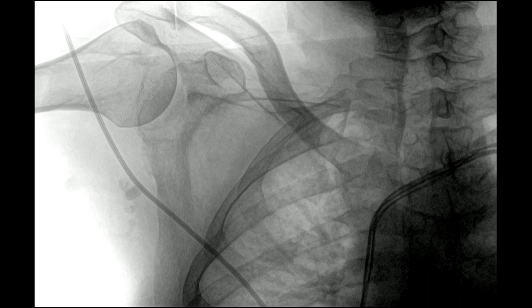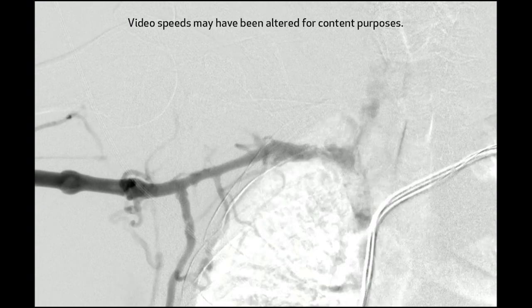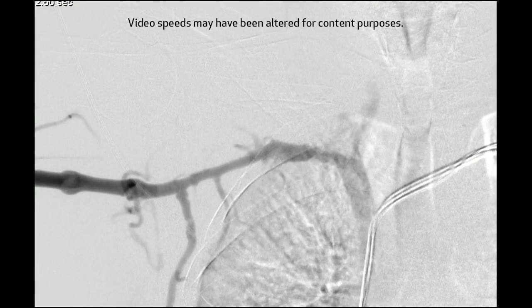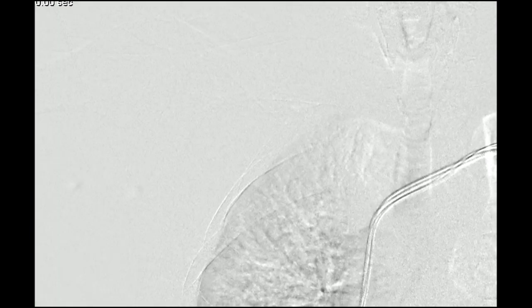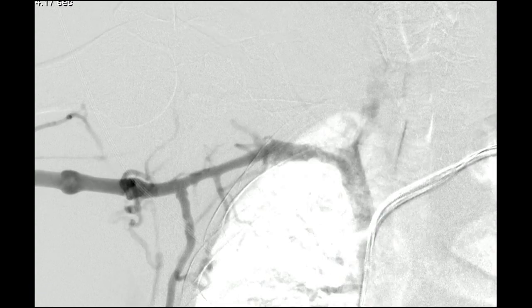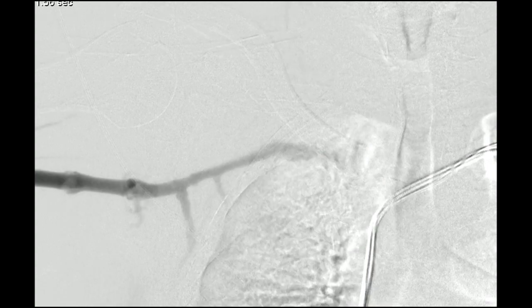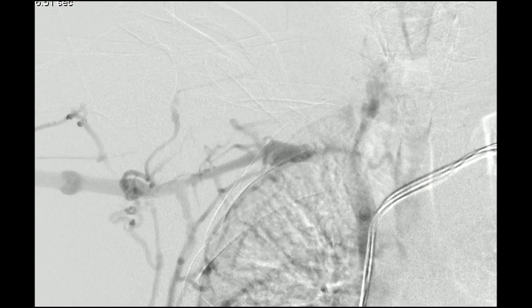Now we've centered on the central part of the chest using digital subtraction angiography. You can see that there is flow in the SVC approximately — it's patent, but we don't get really good opacification. We can exchange this out for a sheath that allows you to put a catheter more centrally and inject directly. You can't really see where the occlusion is at this point, but you can see a whole bunch of collaterals coming off the lateral chest and reflux going up into the jugular venous system on the right.